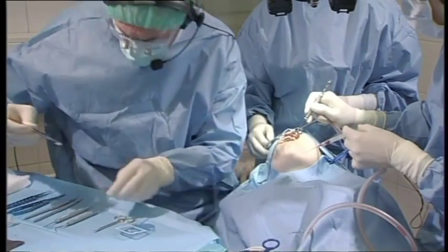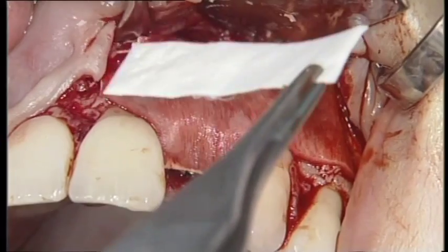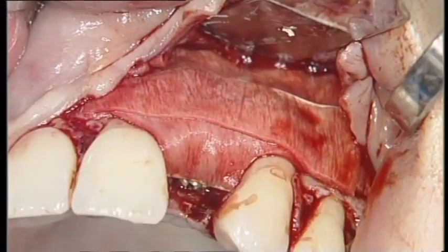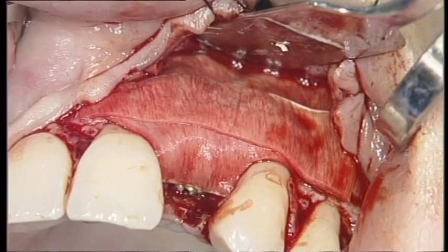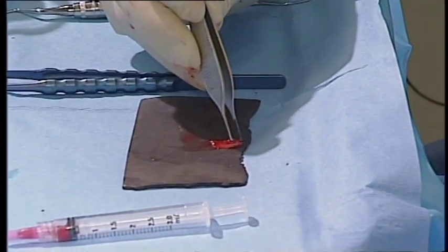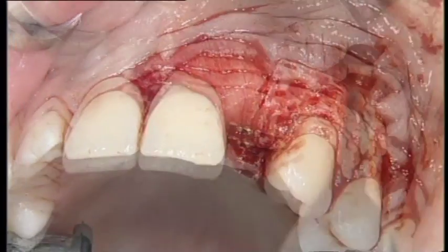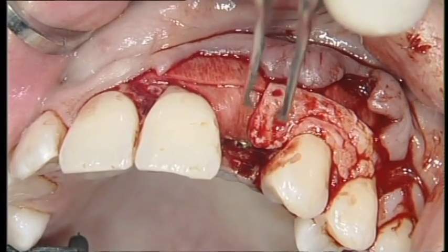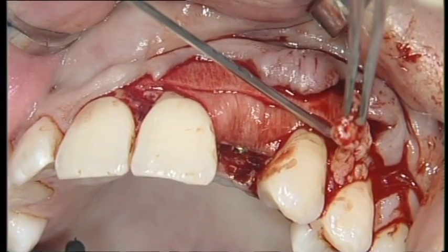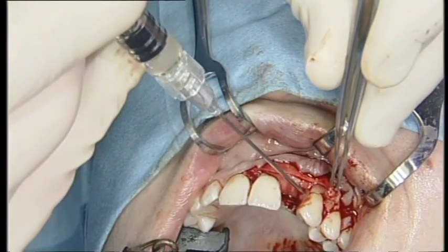A second, smaller membrane strip is positioned over the first layer, according to the double-layer technique, to improve the stability of both membranes. The harvested connective tissue graft is placed over the exposed root surface of the canine to cover the recession. Before the wound is closed, Emdogain is delivered onto the root surface and then covered with the graft.